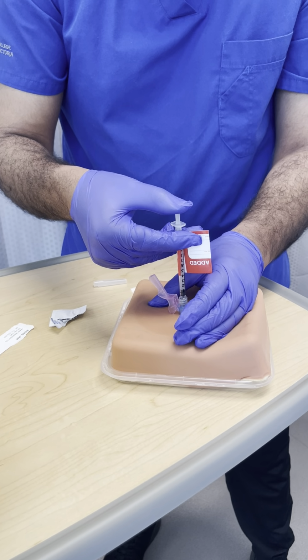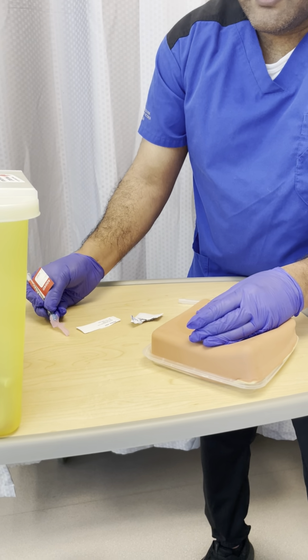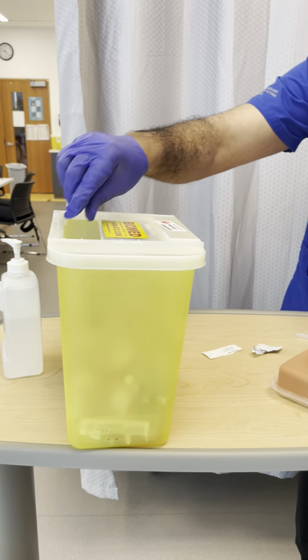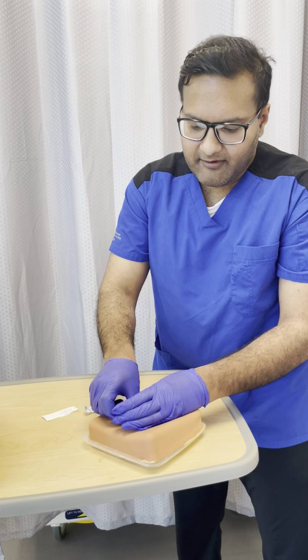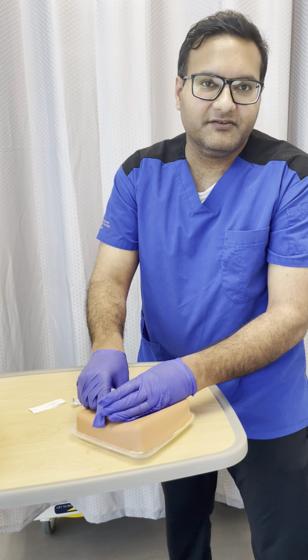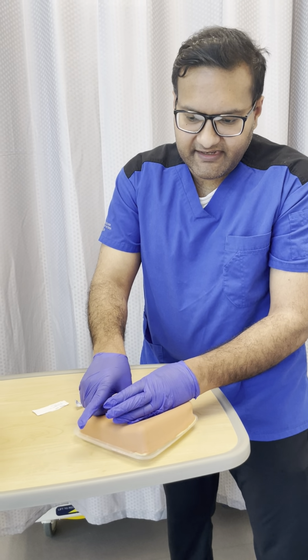I'm going to ensure that the caps are closed and dispose of it. And at the same time, I'm going to apply gauze and apply pressure so that there is no bleeding. And once I do confirm that there is no bleeding, I am going to then remove the gauze.